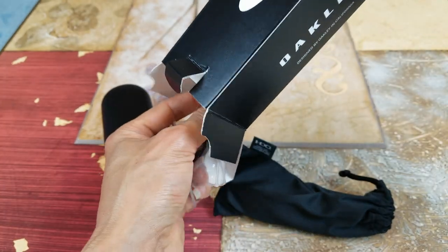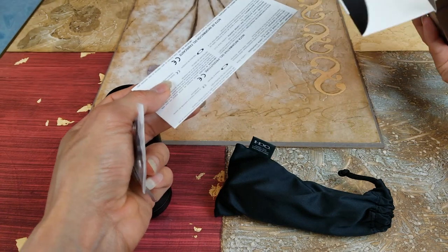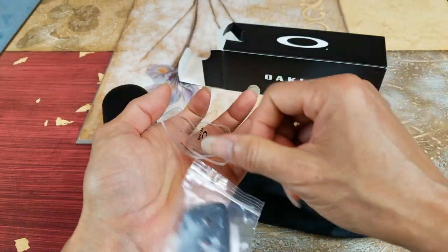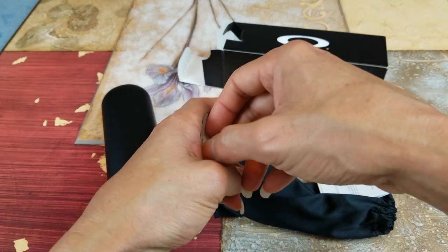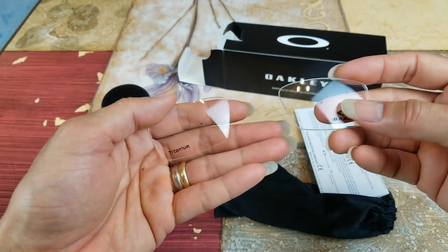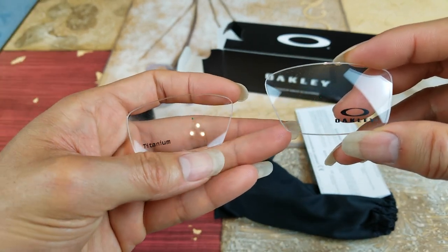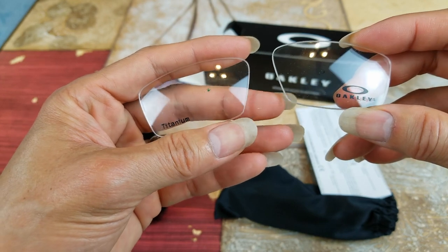I made a special request to keep my original clear lens, and I'm glad they did that for me. This is the original clear lens that came with the frame. In case I don't want it anymore, I can take out my prescription and sell it as is.